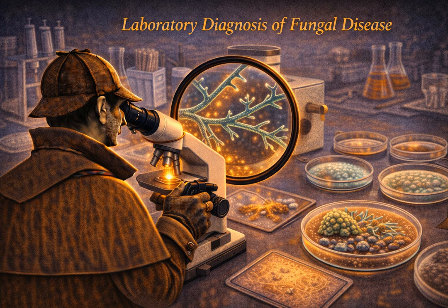Think about it. Imagine you scrape some skin off a patient with a severe rash, or you take a thick nail clipping. If you put that sample directly under a microscope, what do you actually see? Just a wall of skin cells. Layers and layers of dead skin cells. Keratin, protein, cellular debris, oils. It's an absolute mess. It looks like a dense pile of leaves. You cannot see the microscopic fungus hiding in there because the massive human cells are completely blocking the view.